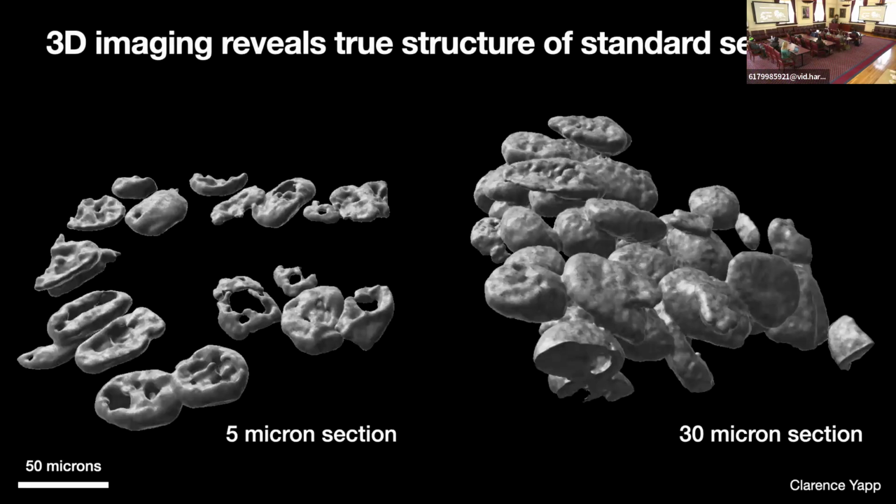So when you go to quantify this image, if your segmentation boundary for the cell next to that half-cytoplasm cell includes part of the cytoplasm, you're going to be quantifying the wrong cell type. And if it's different cell types, you've got an immune cell next to a tumor cell, you're going to get some weird quantification artifacts.